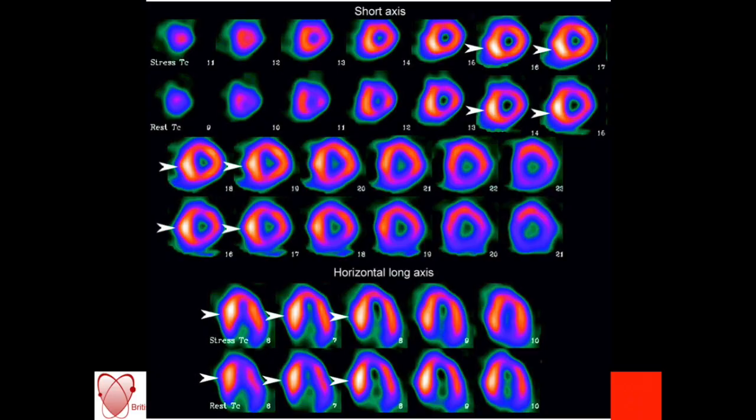Again, staying with the septum, the other condition, also probably quite common, is hypertrophic cardiomyopathy, and the relative hypertrophy of the septum causes a relative hotspot compared to the rest of the heart. You can see the difference here in the uptake between the septum and the lateral wall, and it might cause adjacent relative reductions due to that relative hotspot. But you can recognise the morphology and identify that there's simply more muscle mass, therefore there's more myocytes, therefore there's more uptake of the perfusion tracer.